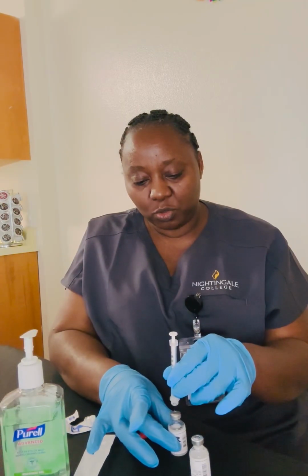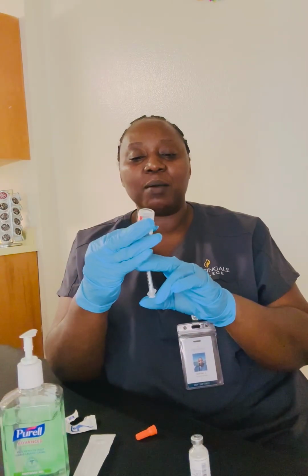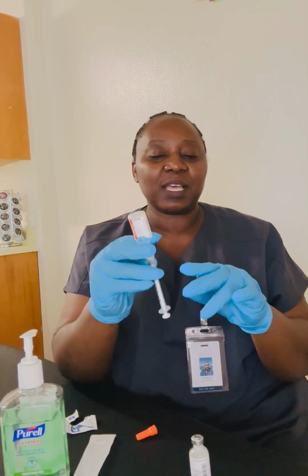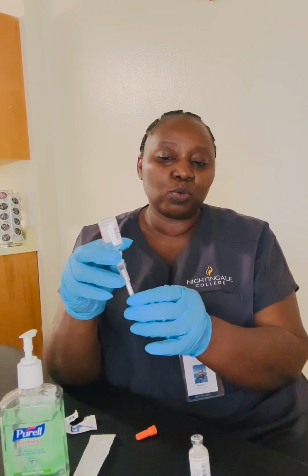Hold like a pencil, push down, push the air, oopsie, and flip over. I'm holding the vial by the neck because I have a very thin needle. I don't want it to bend, and then I'm going to hold it.